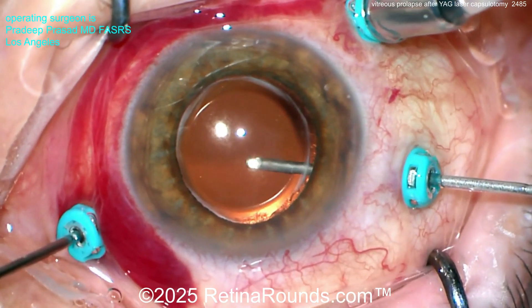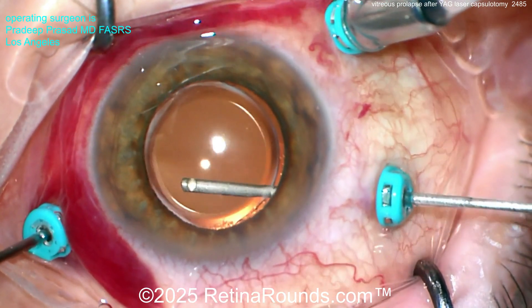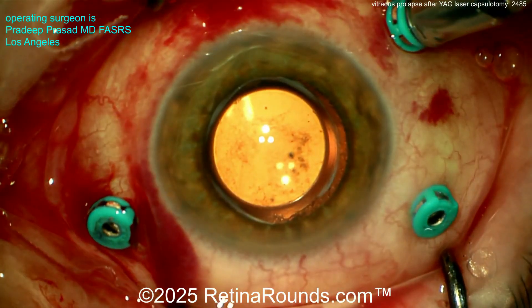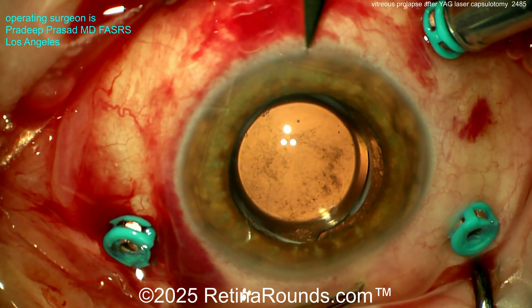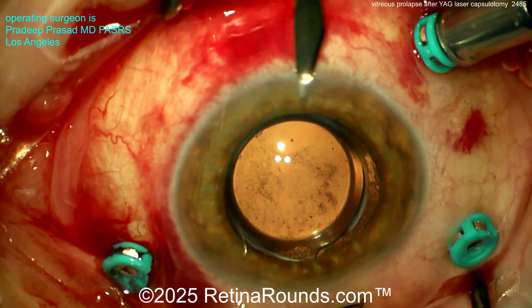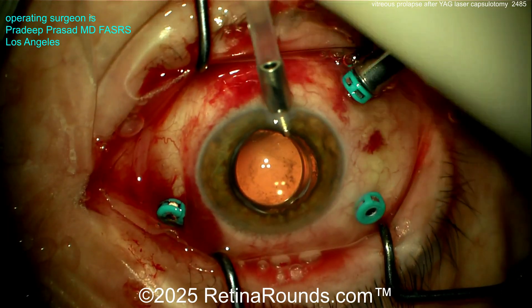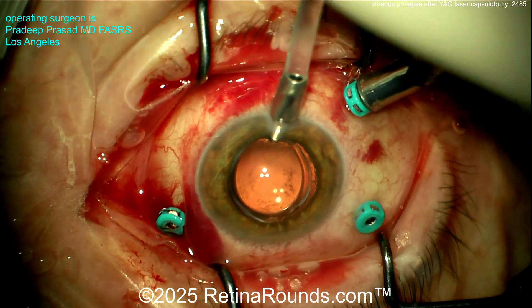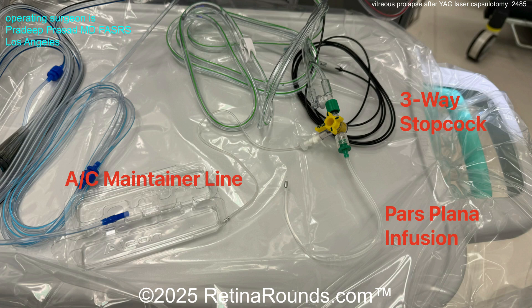Once that's done, we still need to tackle the vitreous that's in the anterior chamber. First, let's make sure there's no residual anterior vitreous just behind the intraocular lens. Then we're going to do the anterior vitrectomy. The vitreous cutter could just be introduced into the anterior chamber, but we really want to make sure that the AC is stable, so we're going to introduce an anterior chamber maintainer. AC stability is important to avoid damaging the endothelium and to make sure the iris doesn't jump into the vitreous cutter port.